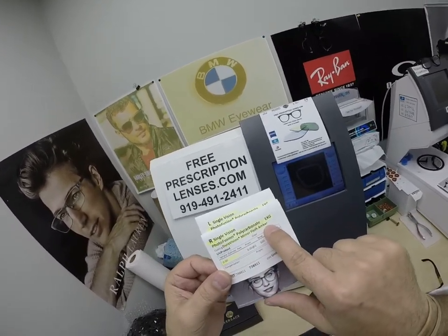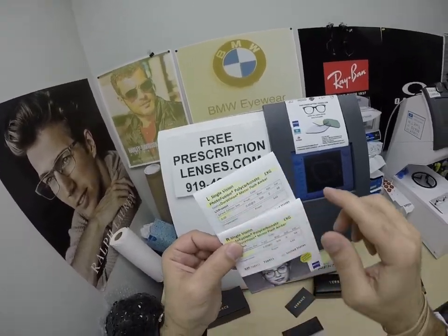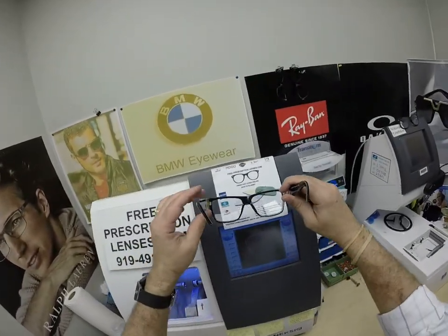Duravision mirror flash amber — which I call the gold. Plano, zero, no power. Same for the left eye. Let's go ahead and show you what they look like with the gold.